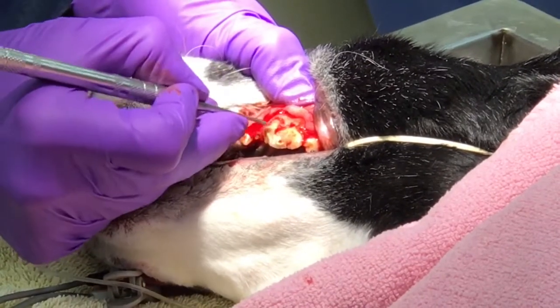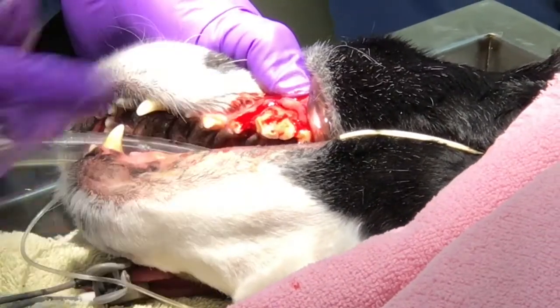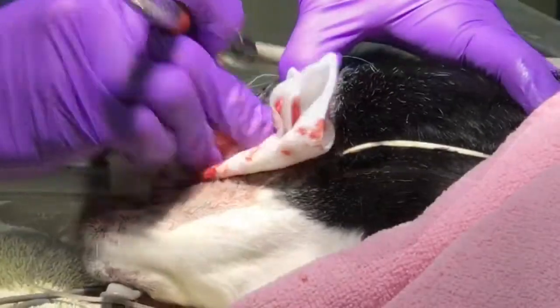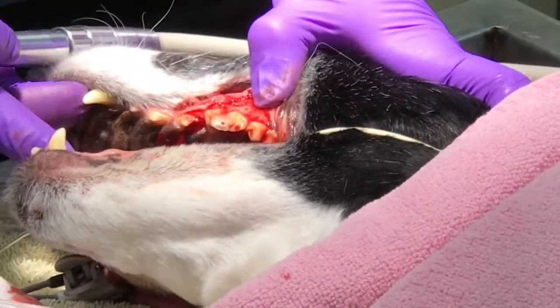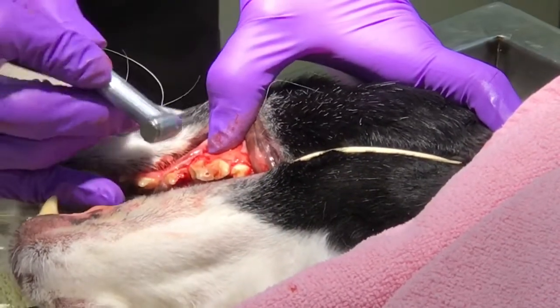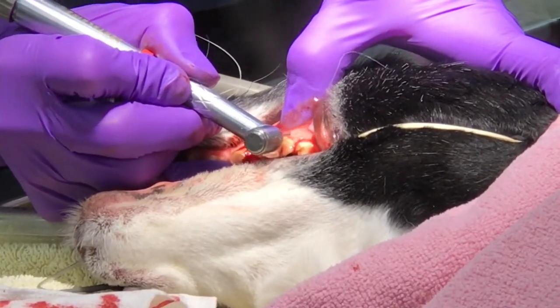Again, when you have a root that has been compromised from the fracture, as well as exposure to the pulp canal, you have what is considered a complicated fracture. Being that this is a three-rooted tooth, we have to get all three roots out. It's not as simple as the Three Stooges, where they just place a pair of pliers and pull. So we're going to have to get away some of this bone.